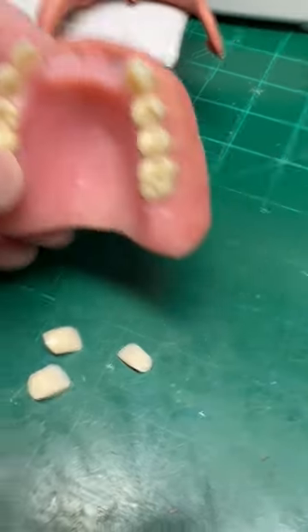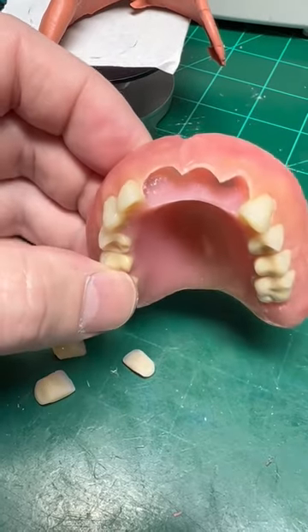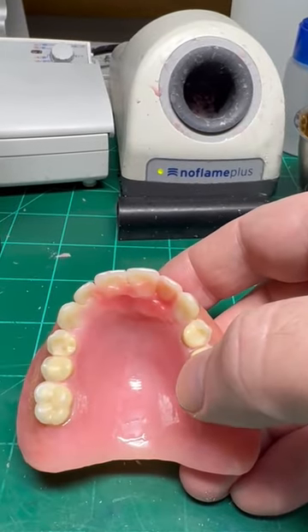So from this point on I'm just going to position the teeth, which I kind of pre-ground, and I'm going to wax them in. At this point we have attached the teeth in wax.